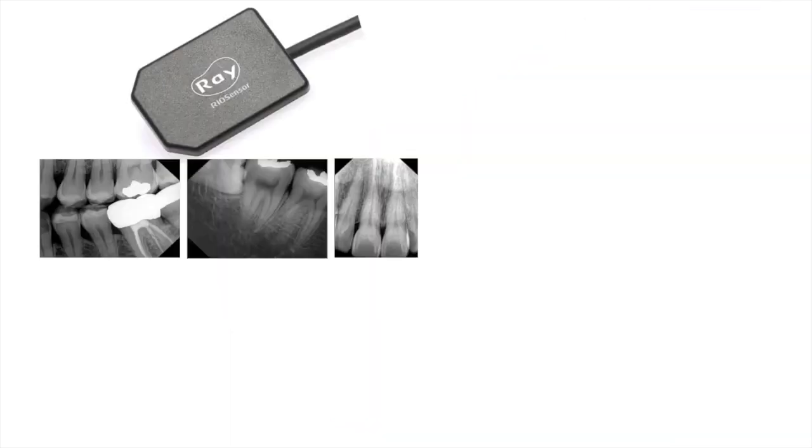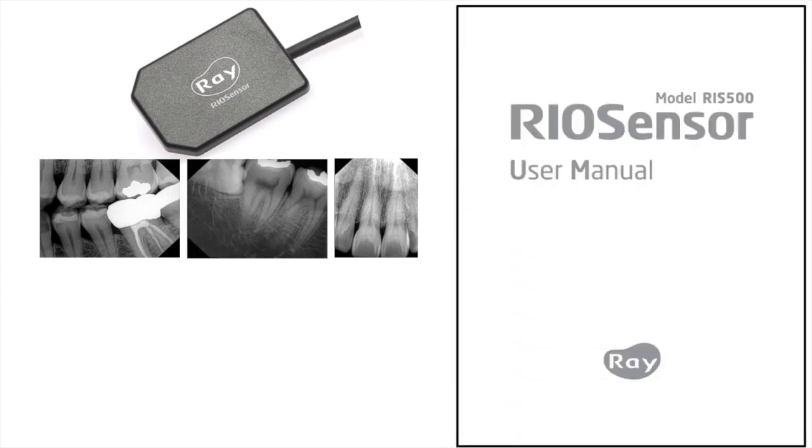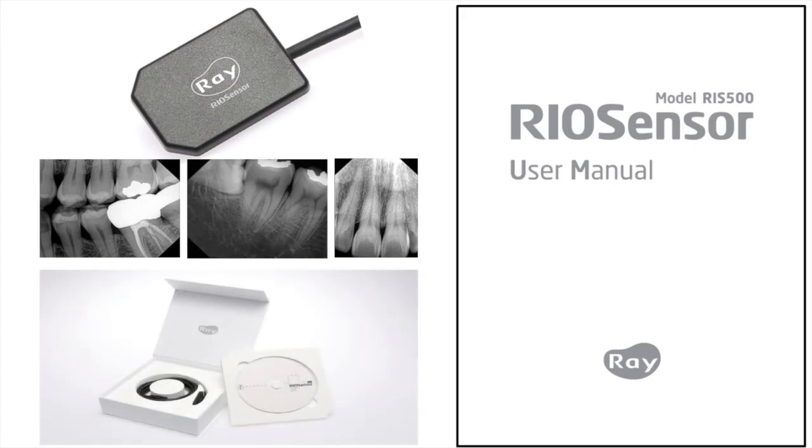The purpose of this video is to learn about the basic fundamentals of the sensor and Rio View imaging software, and the proper techniques that will ensure the safe usage of your Rio sensor. We recommend that you study the manual in its entirety before operating your Rio sensor. You can access the manual on the CD that comes with the package. As the operator, it is your responsibility to ensure the proper and safe use of the Rio sensor.